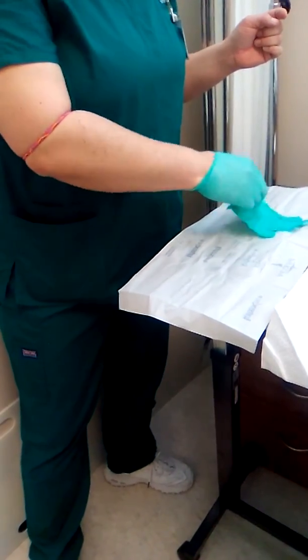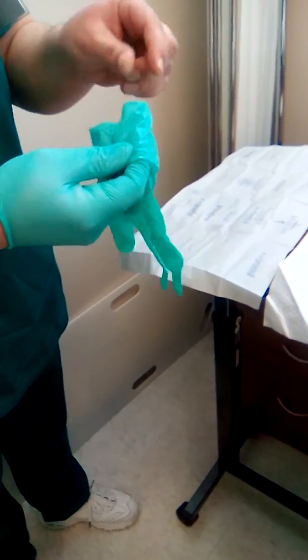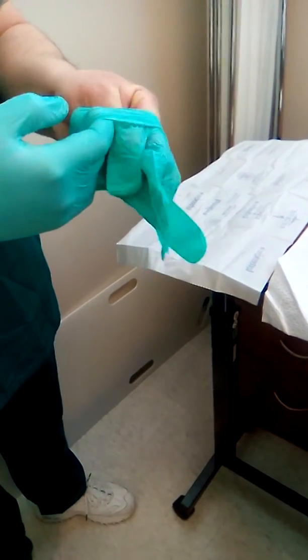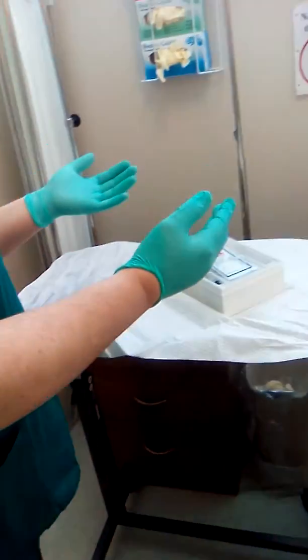I will apply my second glove. Then I will arrange my sterile field.